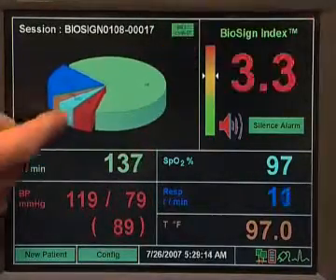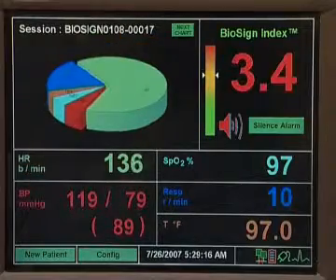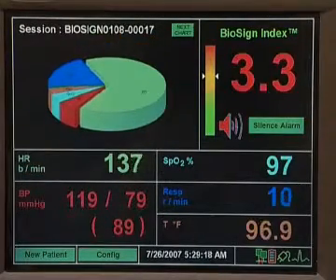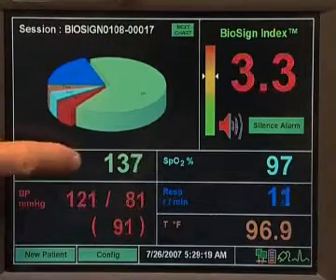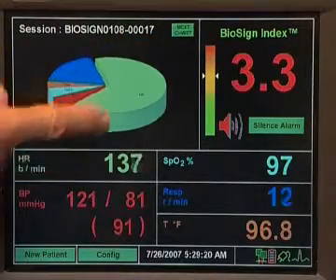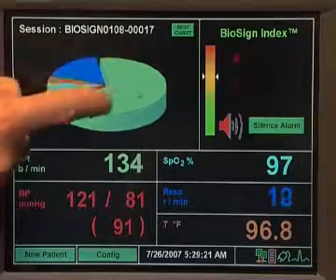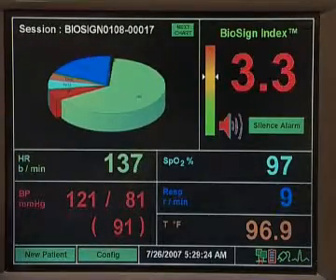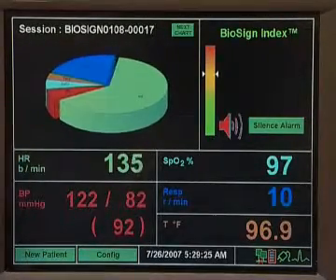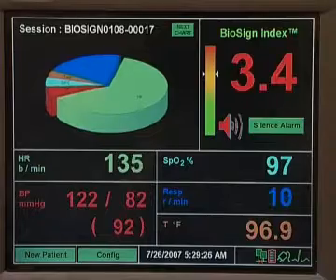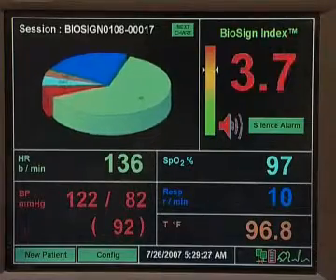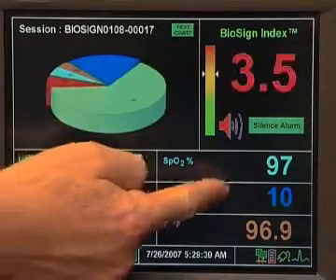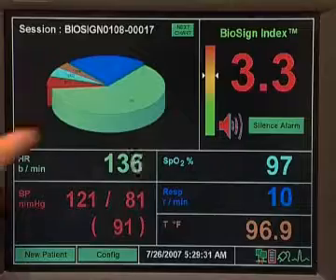She will see immediately that the pie chart is much greater — the radius has increased because the radius is proportional to that number. But also she can see immediately that the main problem, indicated by the color coding, is the heart rate, which takes up most of the pie chart. And the next most abnormal vital sign in terms of ranking is the respiratory rate — the breathing rate — which is low.